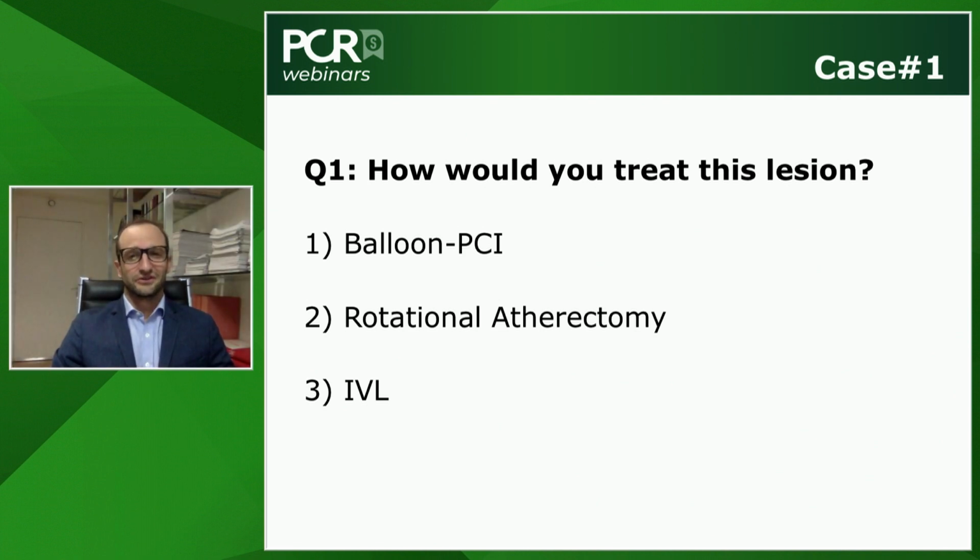It's a challenging lesion. It's critical, it's heavily calcified, it's a huge right coronary artery. I think that we need to prepare the lesion. It's mandatory, atherectomy or IVL, but I see 3 issues with the atherectomy. First of all, it's a right coronary dominant artery, so there is a high risk of AV block. Second, it's critical, and so you have a risk of burr entrapment. And then it's a large vessel, and so you will need a large burr, and so a large guiding catheter, at least 7 French. In this view, I will try IVL first in this very challenging lesion.